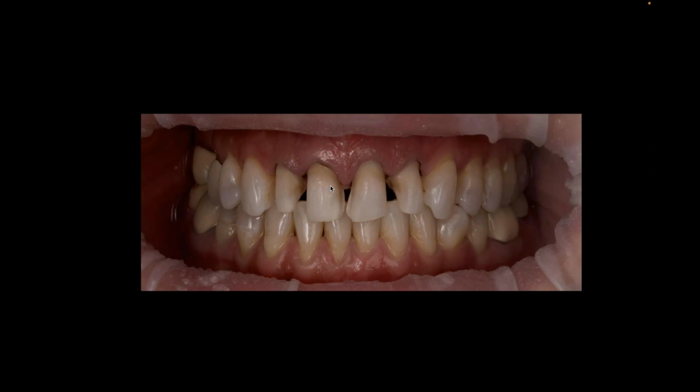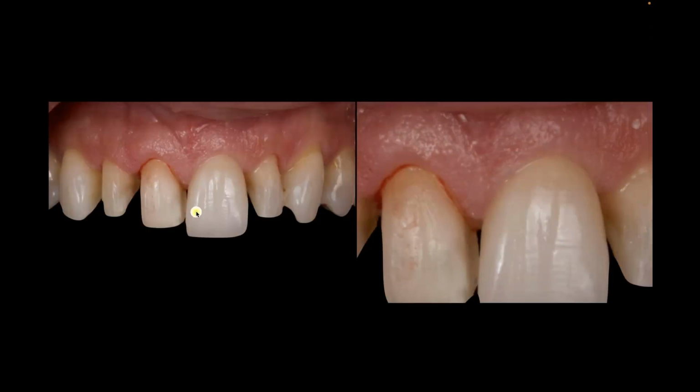Also, you'll notice the management here was really good, and what I mean by that is, look at how nice the tissue looks when they took off their provisionals, right? That's a great sign that the clinical partner really managed it well. And now when they go to place the veneers, it's a nice fit. Look how nice that veneer almost sucks up right to the tissue, right? You can already see some of the coloration of the prep shade coming through. And again, with a monolithic material, you don't have that same luxury because you have one thickness of material. I'm probably sounding anti-monolithic, and I don't mean to sound that way.